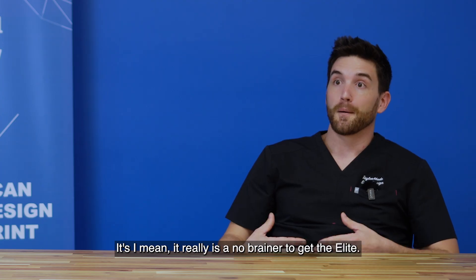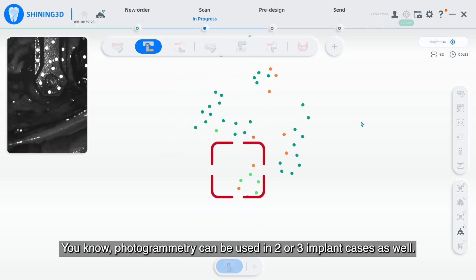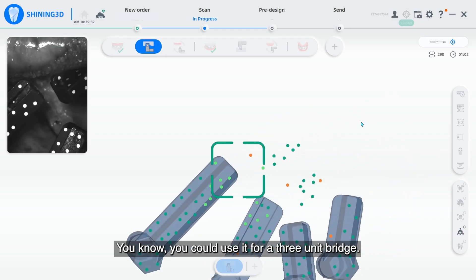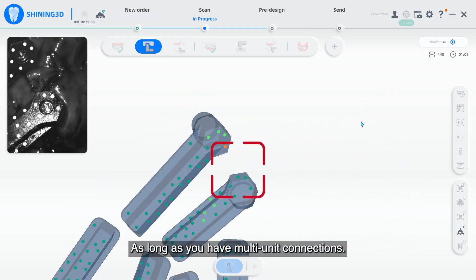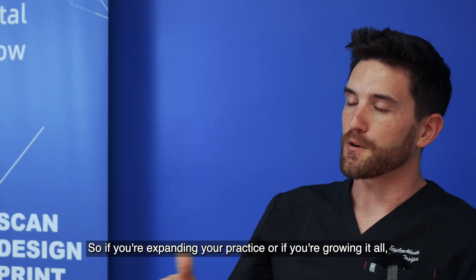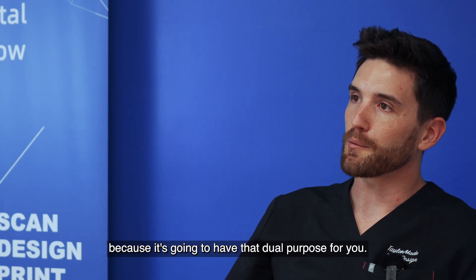It really is a no-brainer to get the Elite. Photogrammetry can be used in two or three implant cases as well — it doesn't need to be a full arch. You could use it for a three-unit bridge. As long as you have multi-unit connections, you can still use the Elite for that application. So if you're expanding your practice or growing it at all, get the Elite because it's going to have that dual purpose for you.